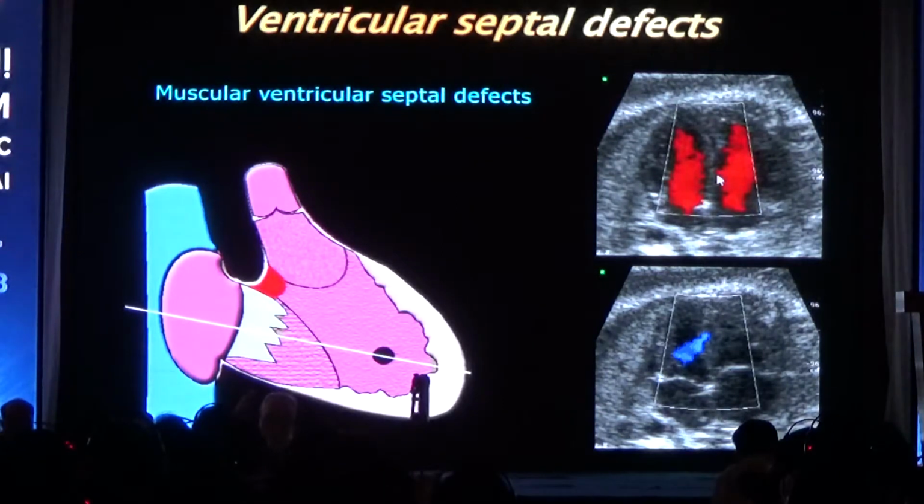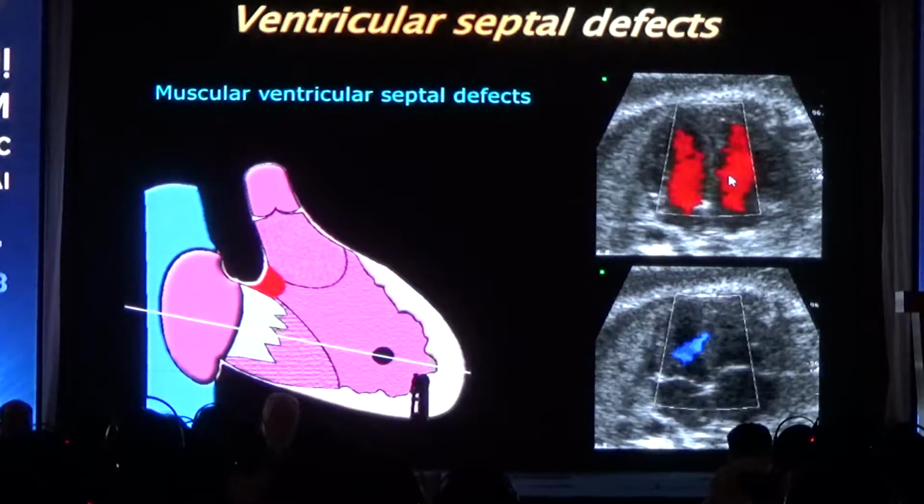So in practice, what you do is get the 4-chamber view, adjust the color Doppler, and then get a little clip, and then go frame by frame for at least 1 or 2 cardiac cycles. You don't have to have 20 cycles, this is too tedious. If you have 2 or 3 cardiac cycles, and you see the defect in the same portion of the cycle each time, you have made the diagnosis.